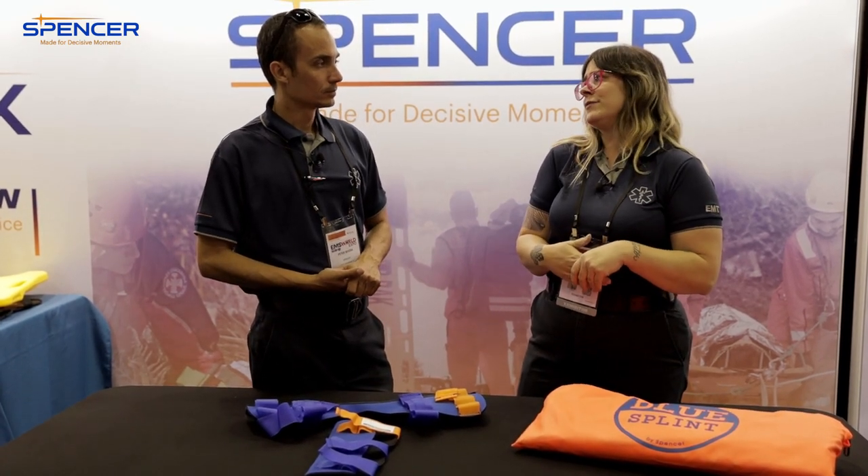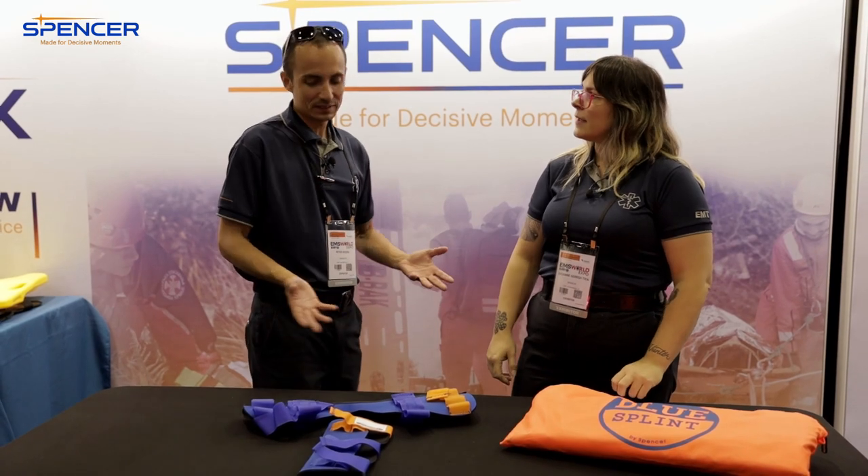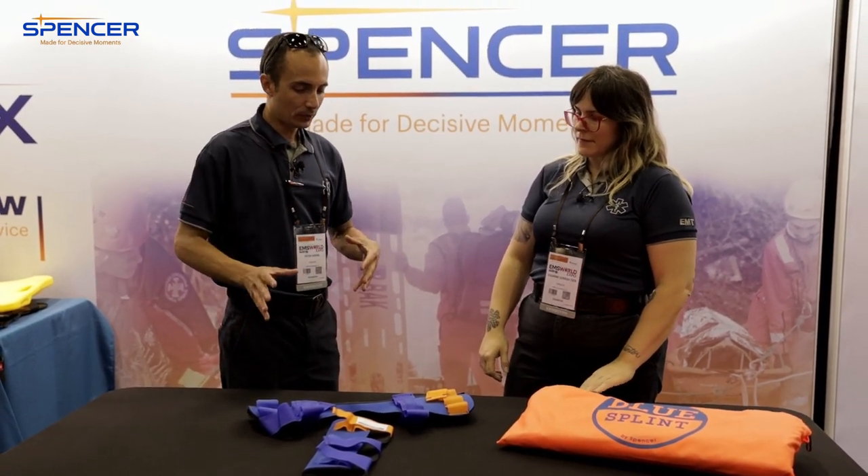So this is a pretty different splint. Why is it different? Well, I didn't think you really needed these honestly. I wasn't sold on it at first, but after Andre showed us this new way of how to use one of the splints, I'm definitely sold on this.